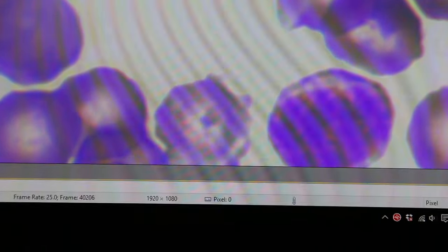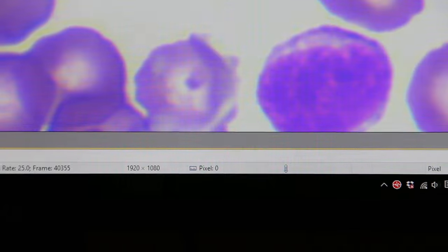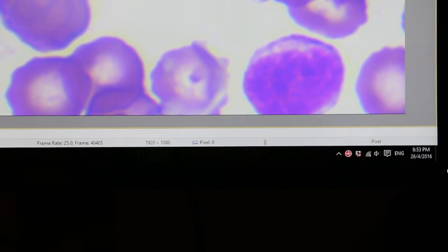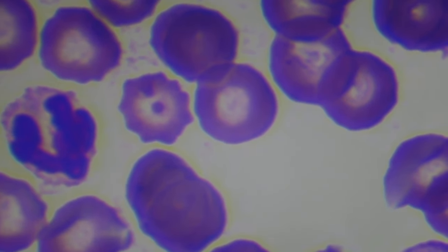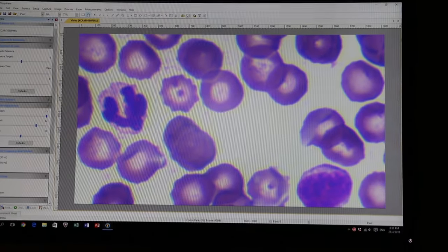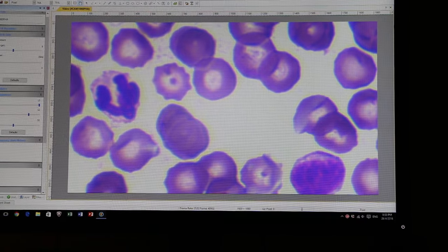Notice the RBC cells have become spiky. And this is another one with the merozoite tear shaped inside the red blood cell causing disruption of the membrane. As well, anemia and thrombocytopenia. Queen's Veterinary Surgery, Singapore, April 26, 2016.